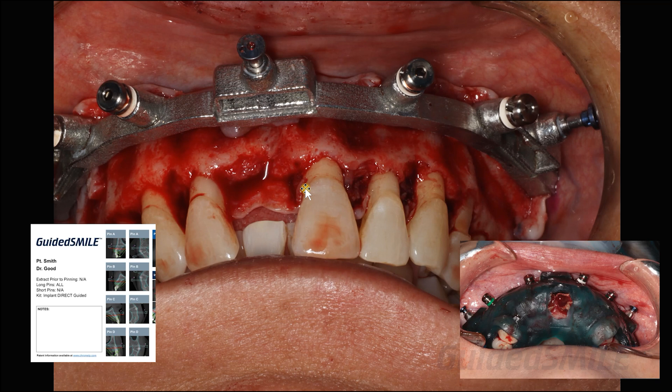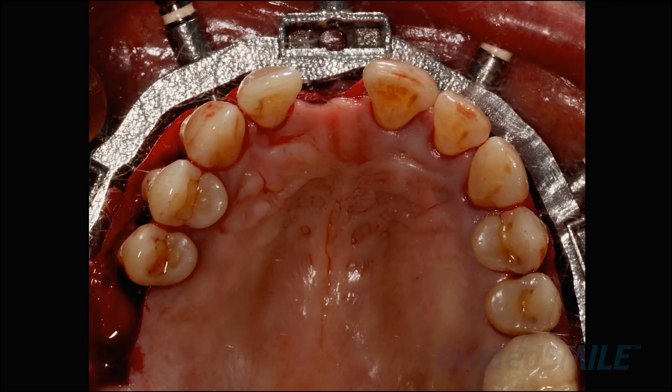If the patient was missing some teeth or had large edentulous areas, you wouldn't apply quite as much pressure, because you could move the pin guide a little bit by putting pressure on the tissue. Once all pins are tapped in — you can hear the noise change when metal hits metal — then you stop. With all pins in, remove the pin guide and perform extractions.